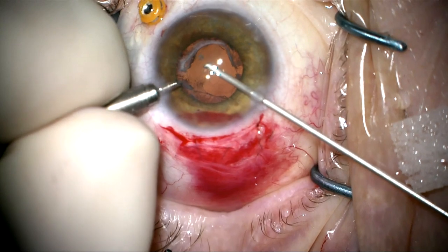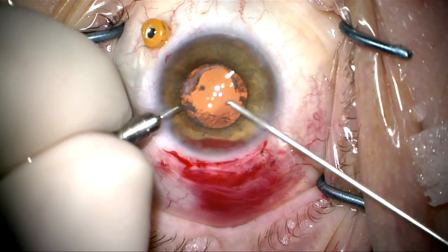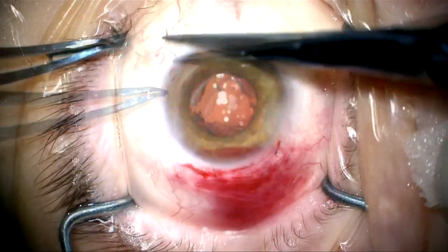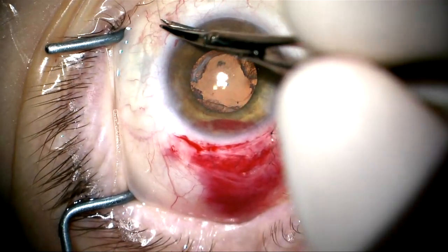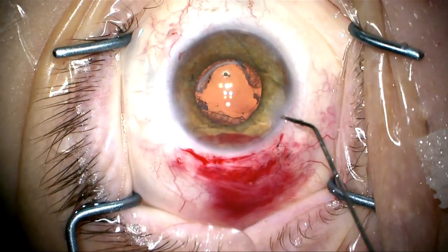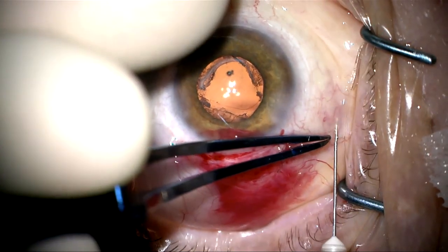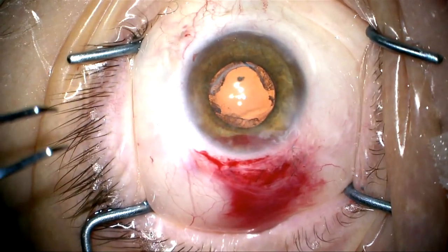We're closing conjunctiva here and pulling the trocar. To remove the viscoelastic I'm going to use an anterior infusion and use a vitrector with the cutter off to remove the viscoelastic from the anterior chamber. The trocar is removed. There's a little gap in the sclerotomy so I'm going to close that with a suture to make sure I don't have hypotony on day one. I firm up the anterior chamber and the lens is very nicely in a stable position. Subconjunctival dexamethasone is injected and the case is completed. Thank you for your attention.